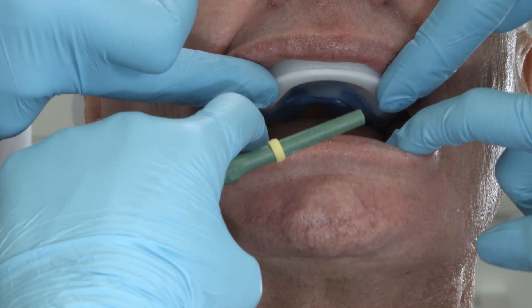Ask the patient to close his mouth. While the patient lightly bites on the bite plates, he is asked to make certain functional movements. He alternates between pursing the lips and smiling. These movements should be repeated eight to ten times. Subsequently, the jaw should remain closed while the material sets completely.